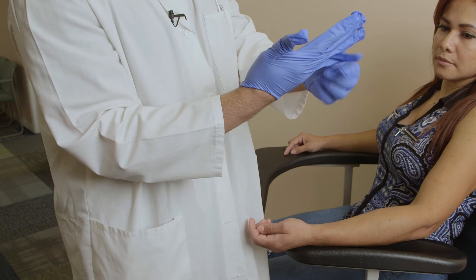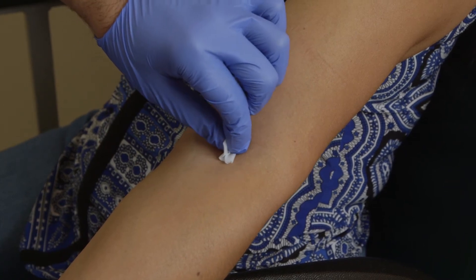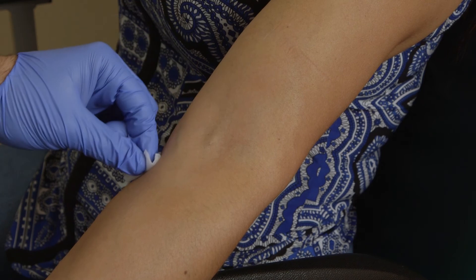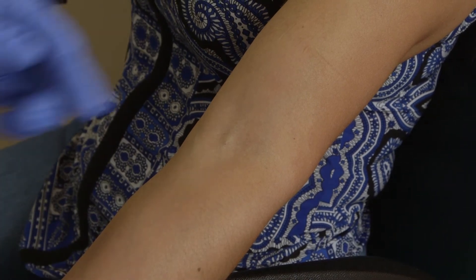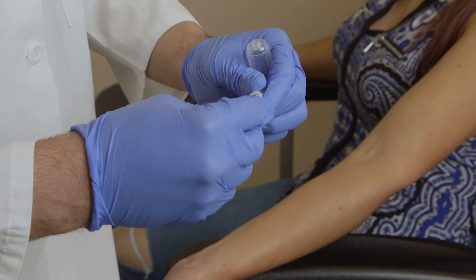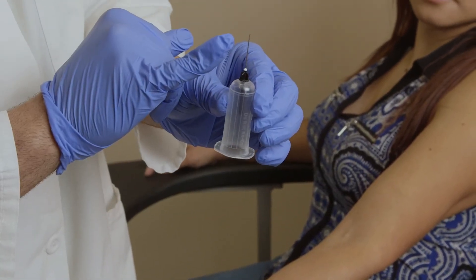I will put on my gloves. I will get my alcohol pad, which is 70% isopropyl. We will disinfect the area using an outward spiral motion, starting from where I will puncture and going outward — this is what we call concentric circles. Once it's clean, we let it air dry; we don't fan it or blow on it. I will prepare my needle while it's drying. Here we have a tube holder and our multi-draw needle. I will remove the cap, revealing the sheath which goes inside the tube holder, and then remove the other end to reveal the needle. Make sure that the bevel is up.